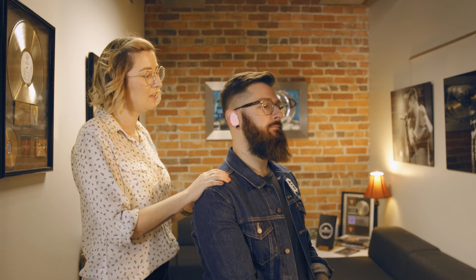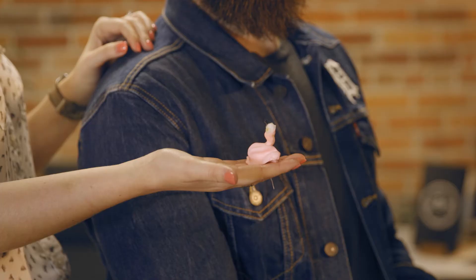It's ready to remove, so now I'm going to have him remove the bite block. Go ahead and wiggle your jaw around a little bit — this loosens the impression and makes it a little bit easier to slide out. There you have it. That's your ear.